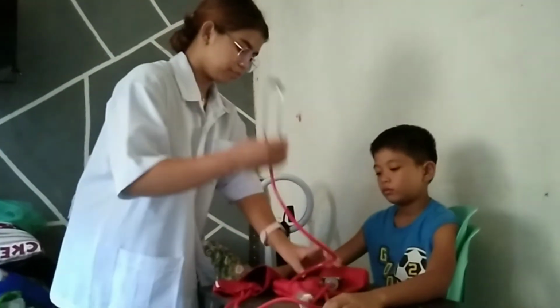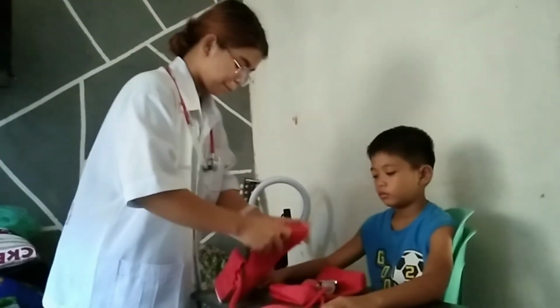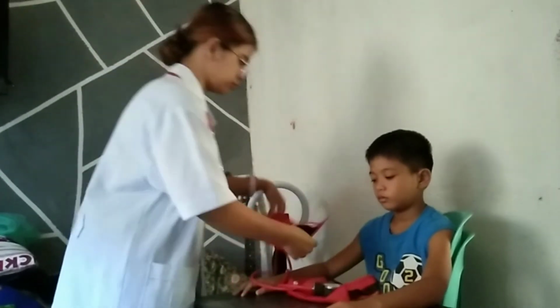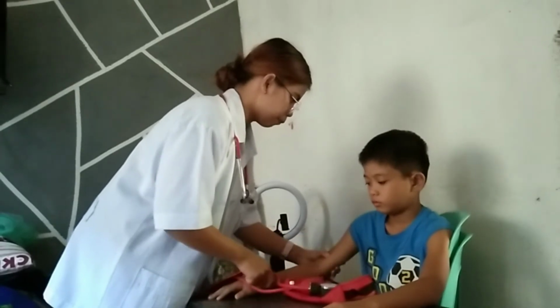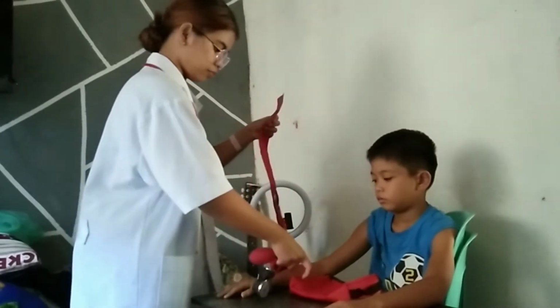Next, we're going to assist the client to a comfortable position, which is the sitting position with the forearm supported at the heart level and with palm facing upward. Next, we need to expose the upper arm of the patient.